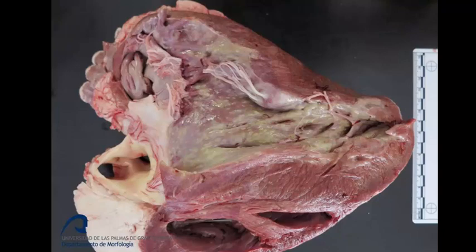Okay, time's up. This is obviously the heart from an ox. The left ventricle has been opened, and there is a greenish discoloration of the muscle within the left ventricle. If you chose Sarcocystis species, you are correct. The condition is named eosinophilic myositis. It can be seen in skeletal muscle, less commonly in the heart muscle. But the congregation of large numbers of eosinophils often causes a greenish discoloration in tissue.